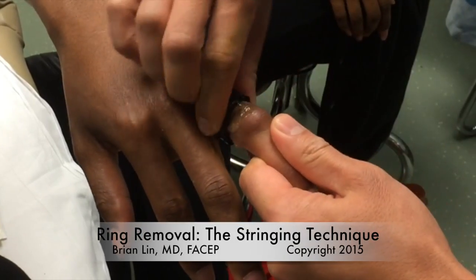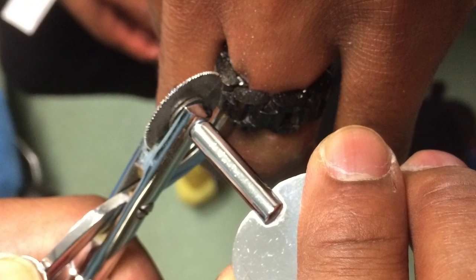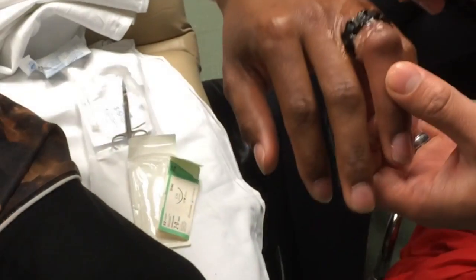This video is a description of the stringing technique, a trick of the trade for ring removal in the emergency department. Every now and then you'll come across a stuck ring that you can't get off, neither with lubricant and force nor even using conventional ring cutters. In this situation, here's a trick you can use.